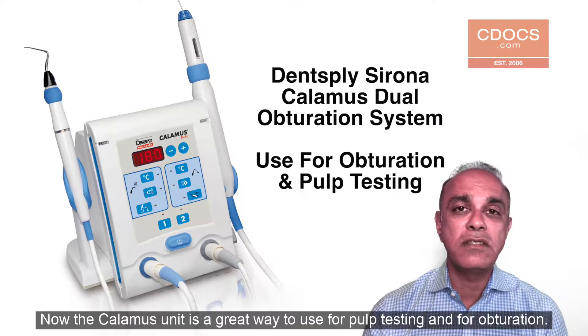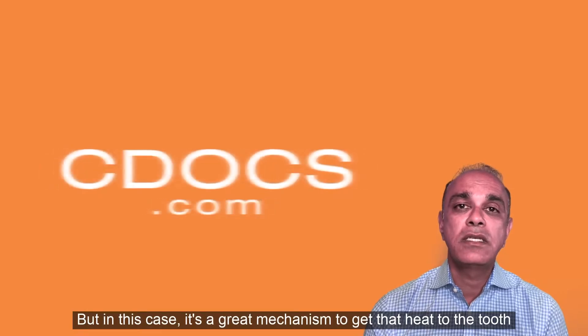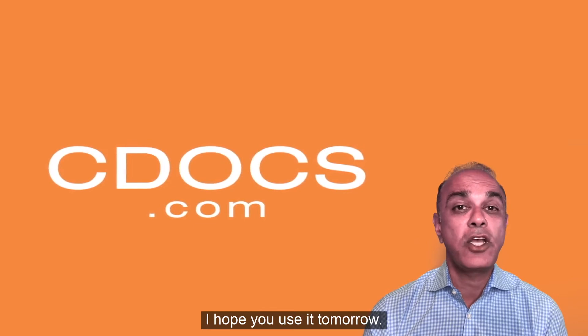The Calamus unit is a great way to use for pulp testing and for obturation, and it's a great mechanism to get that heat to the tooth as fast as possible. Thank you very much. I hope you use it tomorrow.